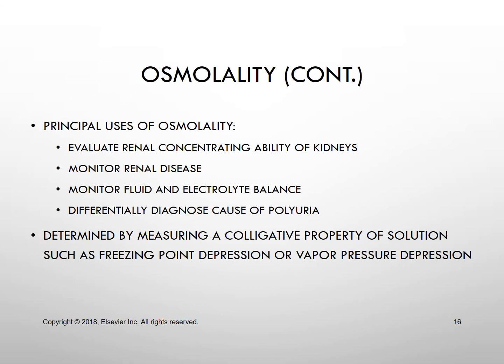So osmolality is really determined by measuring a colligative property of the sample. These properties depend only on the number of solute particles that are present. The size and the ionic charge have no effect. Only the number of particles present as ions or undissociated molecules affects the result.